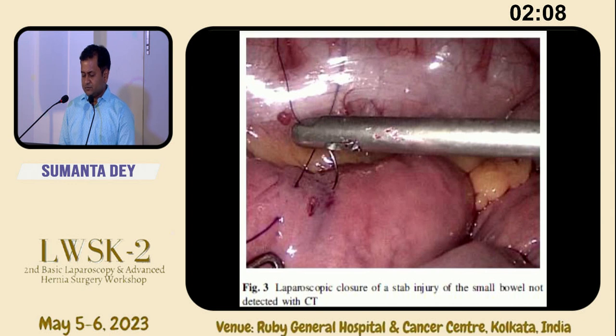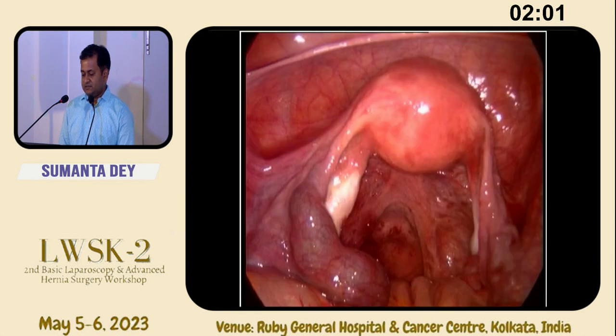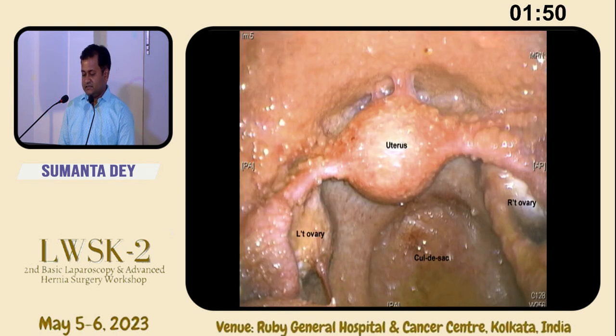You can see the laparoscopy closure of the stab injury of the small bowel, which was actually not detected in the CT. Coming to the uterus, you can see the fallopian tubes, the left fallopian tube, you can see the pyosalpinx or hydrosalpinx, something is there. Then the next slide, I would like to show this one.